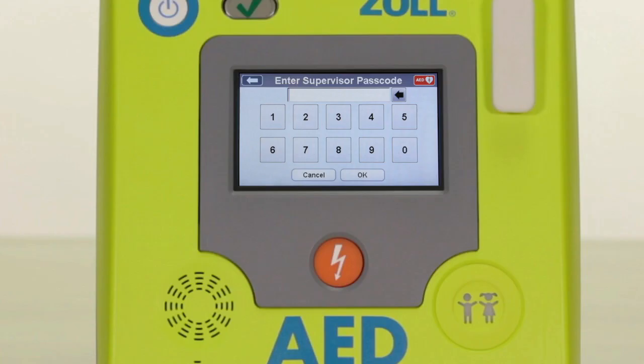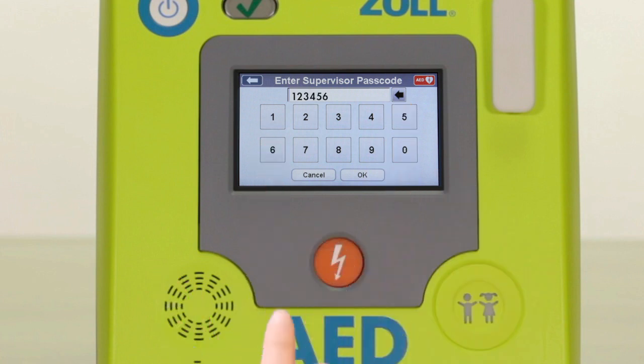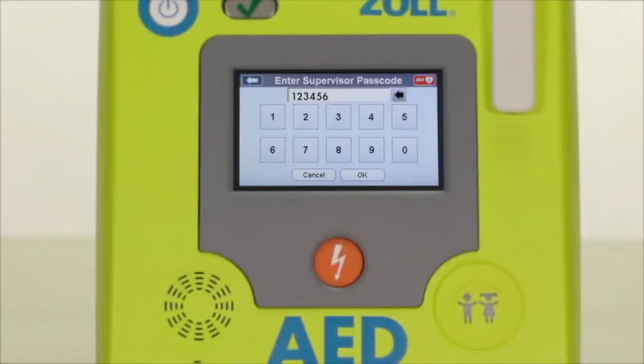The default passcode on a new Zoll AED3 is 123456. If you wish to, you can create your own passcode in the advanced configuration settings. We will cover this later in this video when we discuss advanced configuration settings.